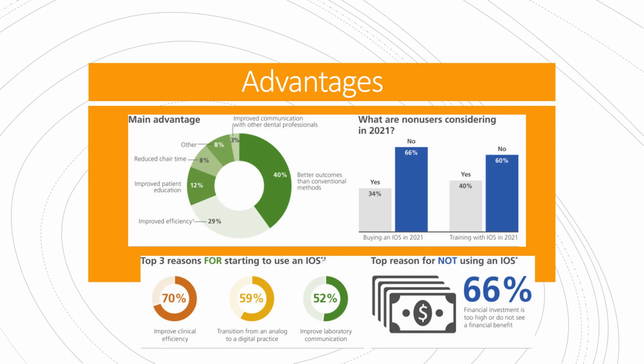So if I've been telling a patient that they've been grinding and we've been recommending a night guard for 3 years now, and they're like, well, I don't think I grind, you're able to show them the tooth loss, the enamel wear from 5 years ago to today, and they can visually see that difference because it does kind of like a boomerang where it shows the previous and the current, previous and the current, which gives the patient the ability to actually see the difference and see that you are not lying to them and what you're saying is a fact.